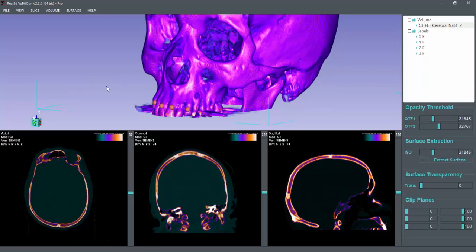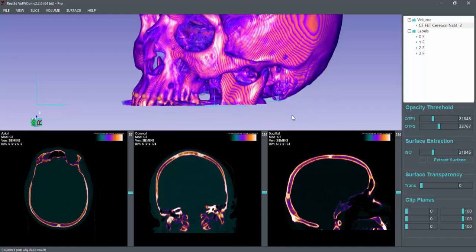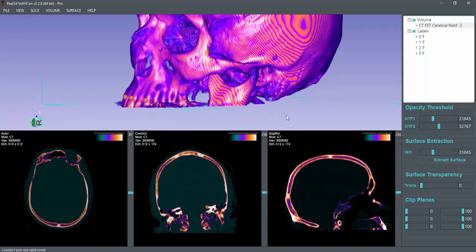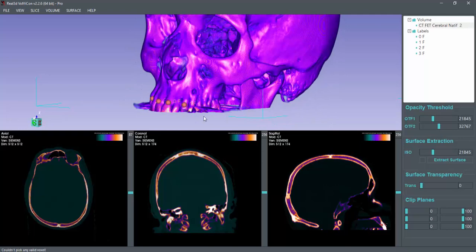For creating points using mouse clicks, the volumetric data should not be translucent. If it doesn't find any valid voxel, it will not draw any points on it.